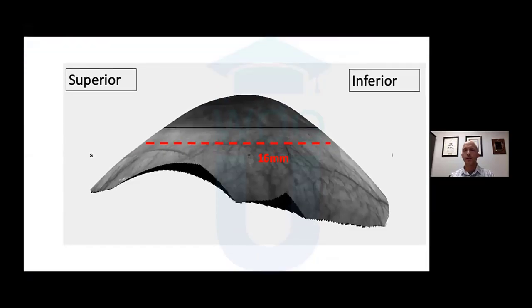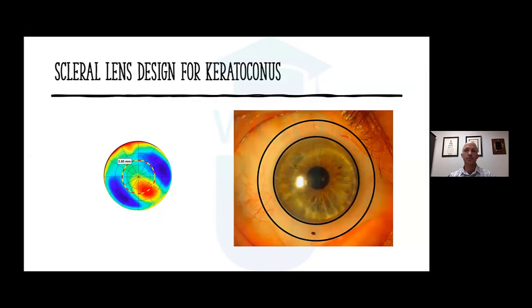And so this is how this might look. If we look at a three-dimensional model of this keratoconic eye, and we find the location of the steepest area of their cornea, what we tend to see is that their sclera is steepest in that same axis. The consequence is that if there's asymmetry or a quadrant-specific effect, the landing zone of, let's say, a spherical design scleral contact lens won't fit quite as well. Additionally, this causes the scleral lens to slide downhill, so we'll get inferior decentration.